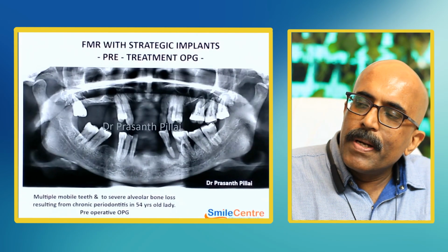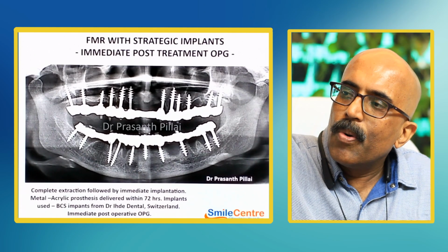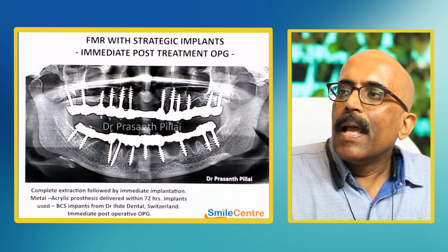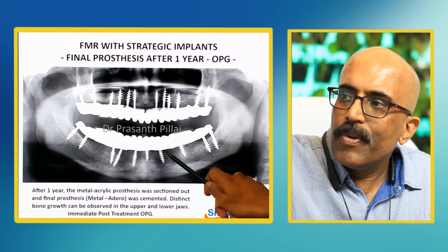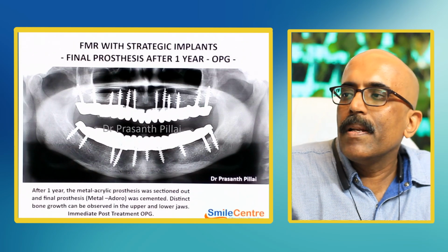That is the preoperative X-ray before the procedure. This is the immediate postoperative X-ray. You can see the bone loss here, and mind you, we've done the implants without doing any bone graft. And this is the 1 year postoperative picture. You can see how beautifully bone has grown all around. And this X-ray was taken soon after we've provided her the final prosthesis.